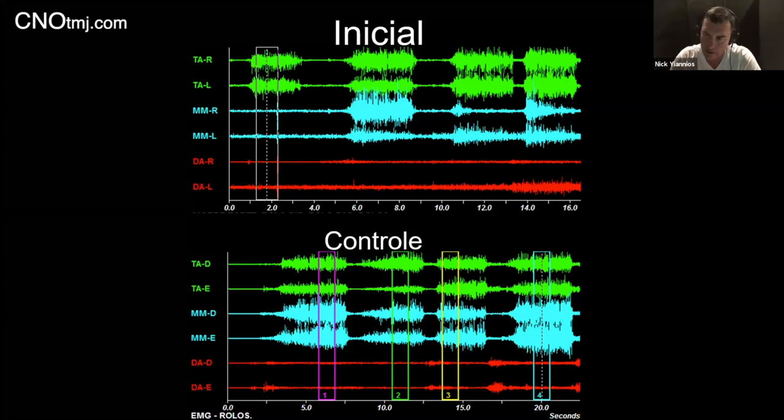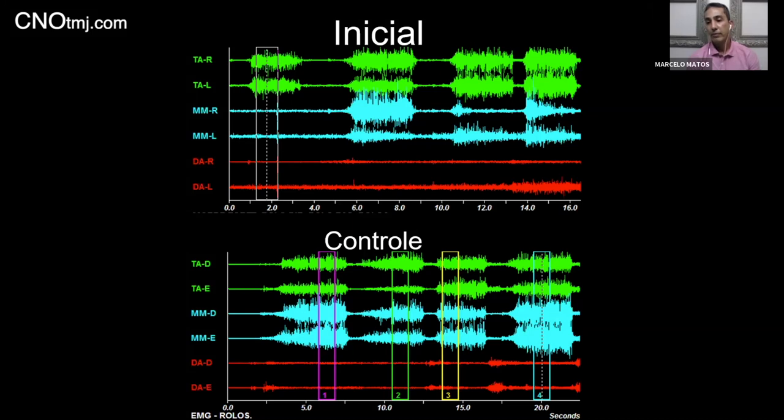I see the patient every 2 months mostly. Right, so is it unusual every 2 months to be adding a new liner to, say, the orthotic, or removing it, or allowing the mandible to go a little bit forward or left or right, whatever the joint is asking? And also it stabilizes.